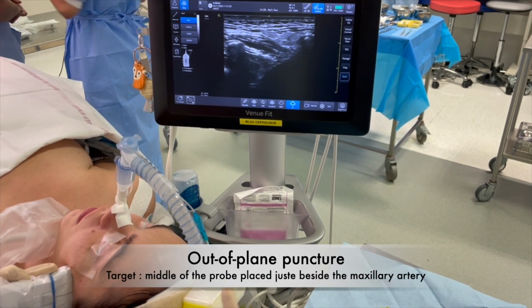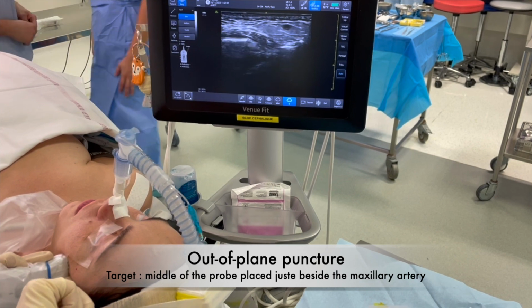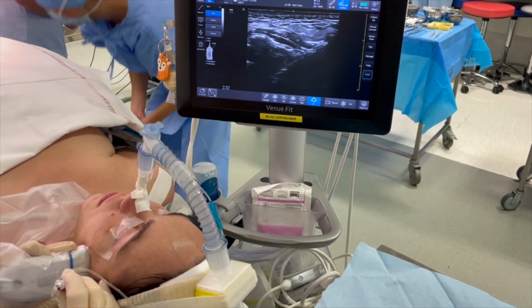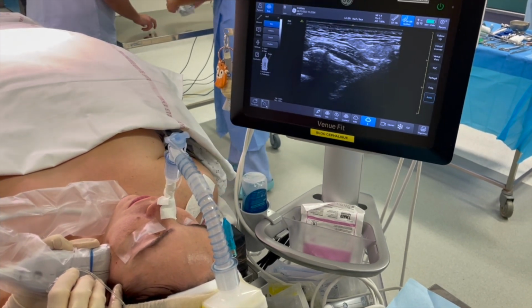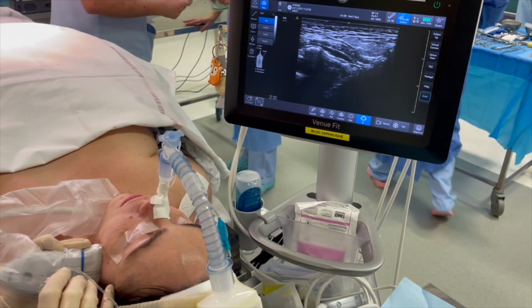The out-of-plane approach involves puncturing 2 mm from the probe, aligning the midpoint of the probe just anterior to the maxillary artery if identified.